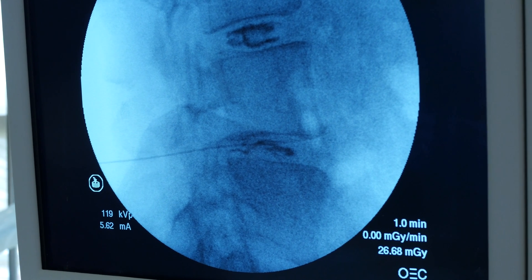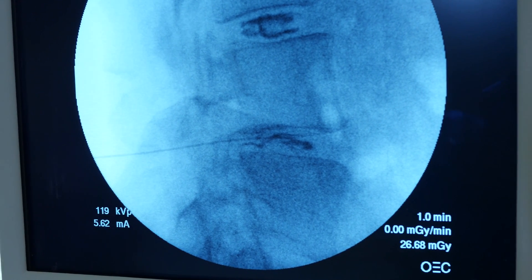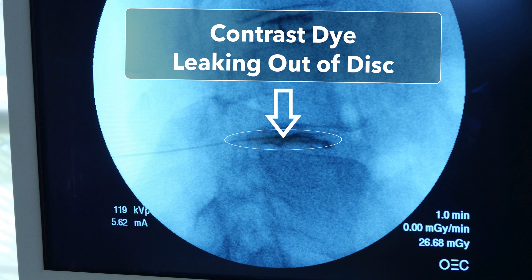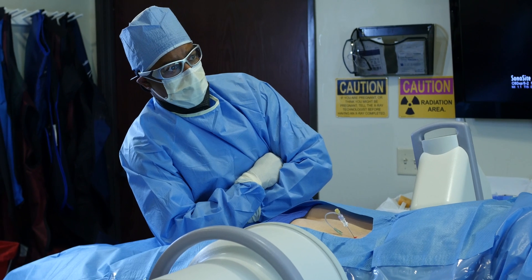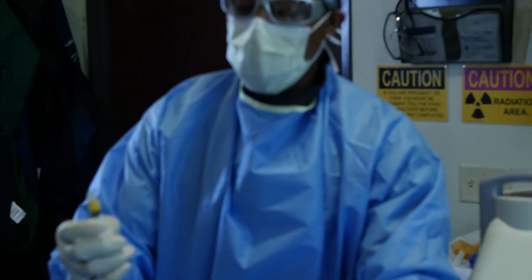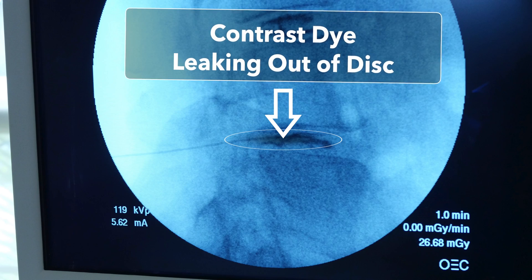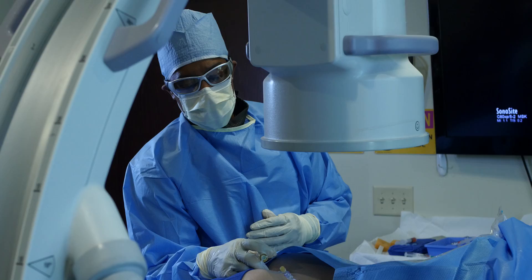Now we can see excellent contrast flow within the center of the disc. On a normal disc it should look like the one above, where the contrast stays right in the middle making a nice oval. Here we see the contrast extravasate out posteriorly — towards the back, or left of your screen — due to that annular tear in the disc. That'll be the area we treat. So now we can see that we're precisely where we want to be, and now we're going to inject our biologics.